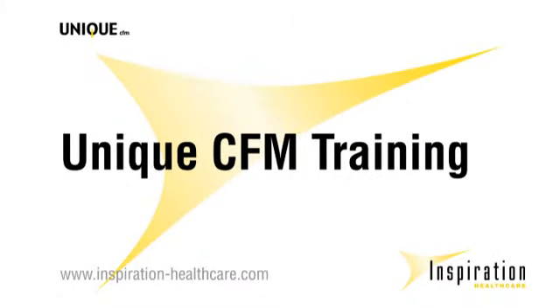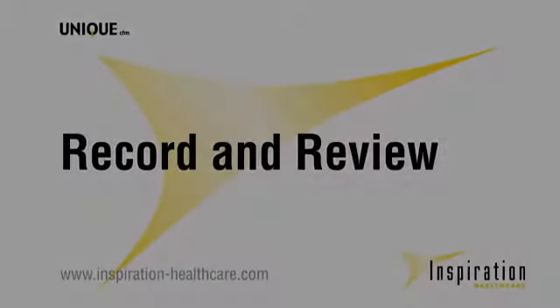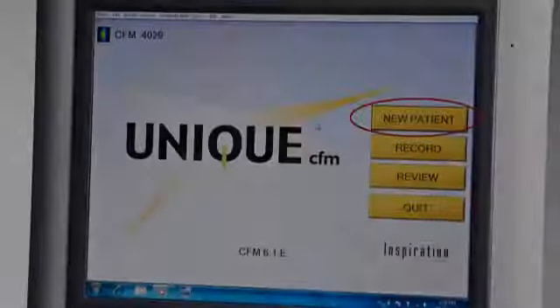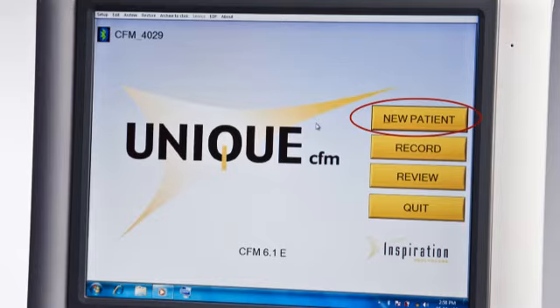Unique CFM training from Inspiration Healthcare. Record and review. To start recording a new patient, click on the New Patient button.